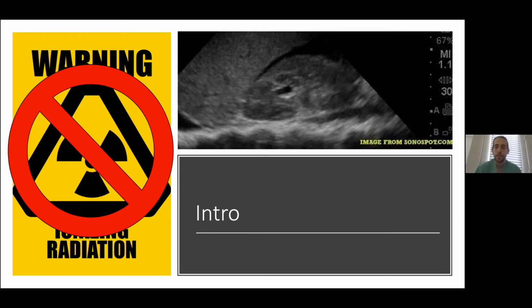Secondarily, there's the benefits of lack of radiation and cost, which we find with a lot of our ultrasound imaging. However, there are some limitations, namely that the FAST exam only identifies free fluid and not injury location per se, which could help with operative planning, and also does miss lesions that aren't developing large amounts of free fluid, at least immediately.